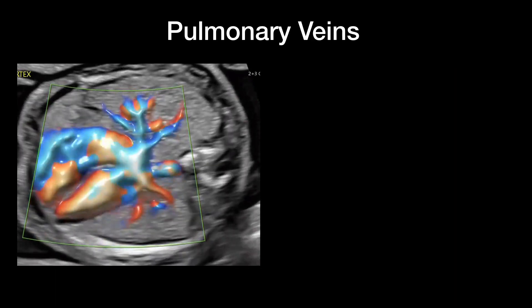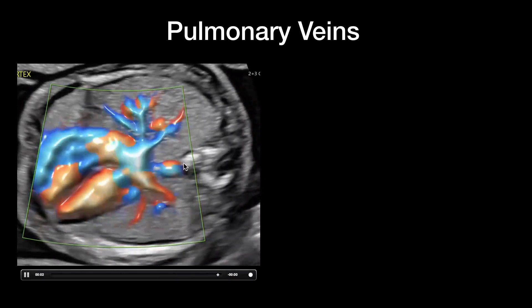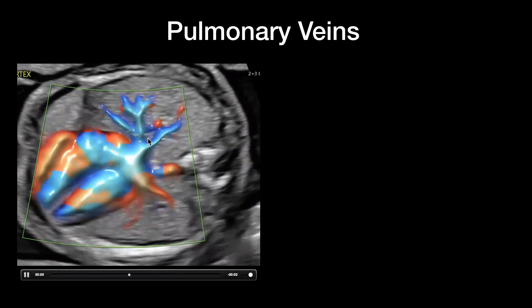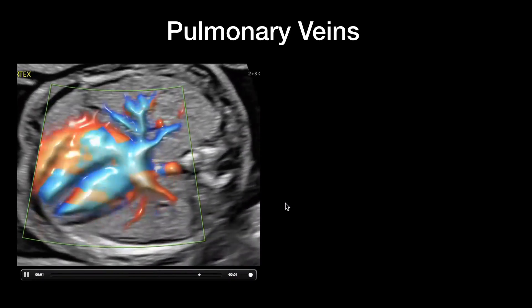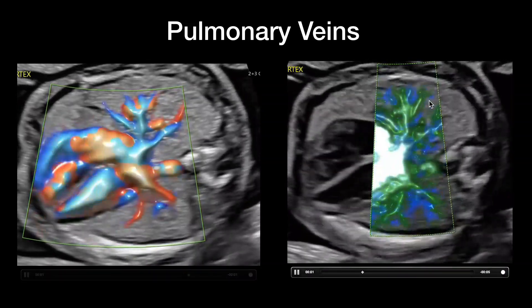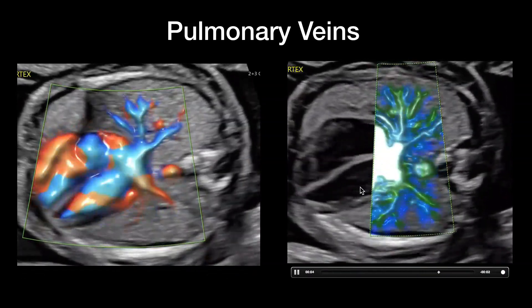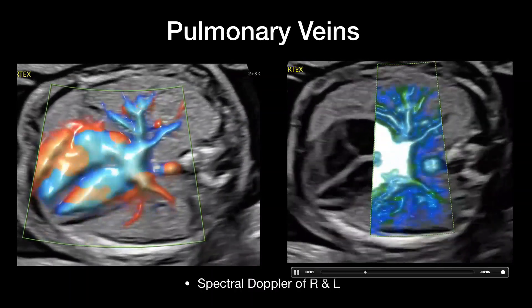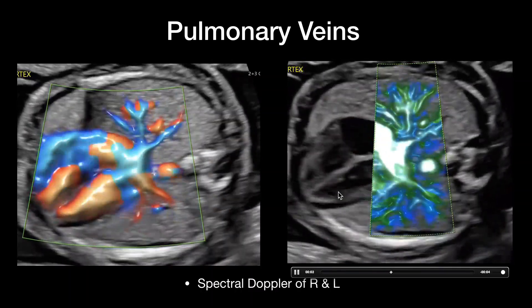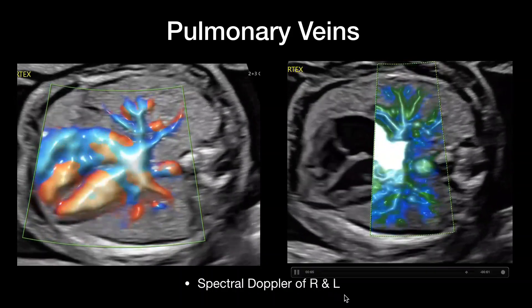For the pulmonary veins, you should see at least two — one on each side. With newer technology, you can see all four of them, as you see right here, and with newer modalities you can see the whole branching. But you need to see at least two, and you need to do spectral Doppler of one on the right and one on the left.